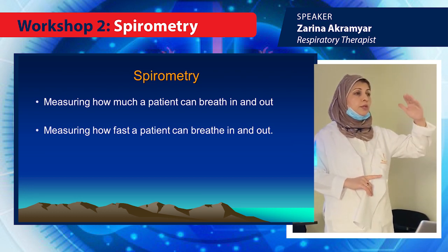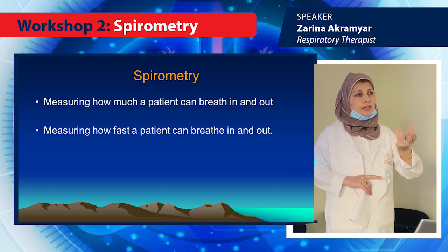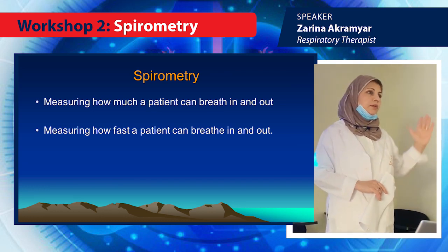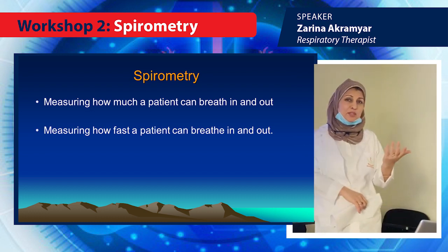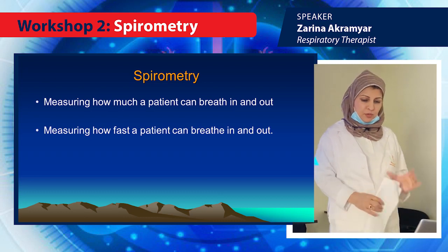As the patient is doing the maneuver, we give them some vocal encouragement. For example, we say blow, blow, blow, blow. If you say blow once, they will blow and then they will stop. They will not continue, right? So this is important.